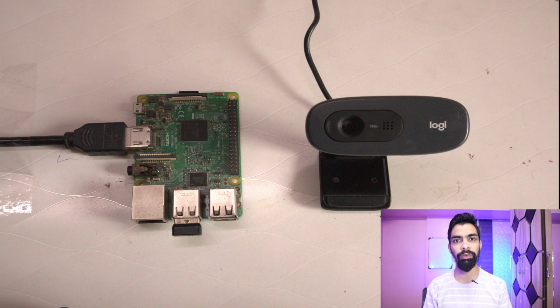Hello friend, in today's session we will learn how we can design and develop a project which is completely useful for blind people. So you can see on the screen we have the Raspberry Pi, and we only require a USB camera for this project. Before starting the next part, I would like to tell you what the flow of this project will be.